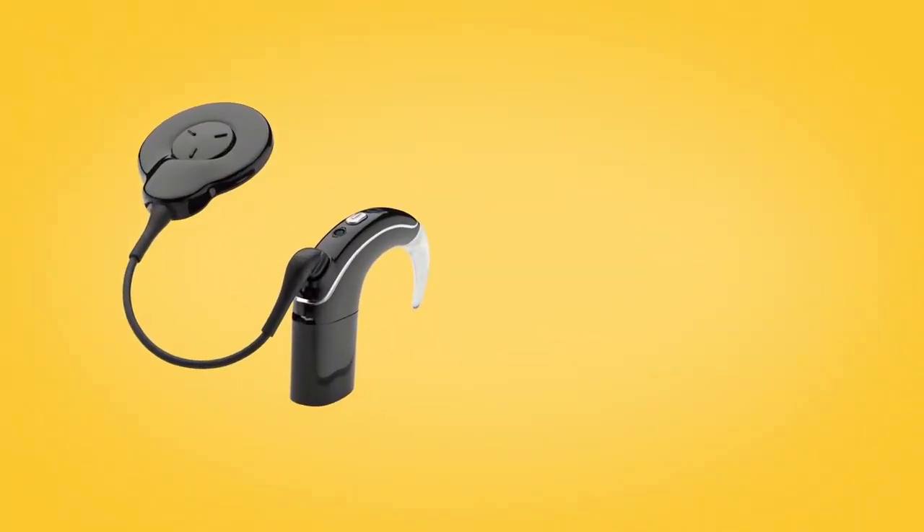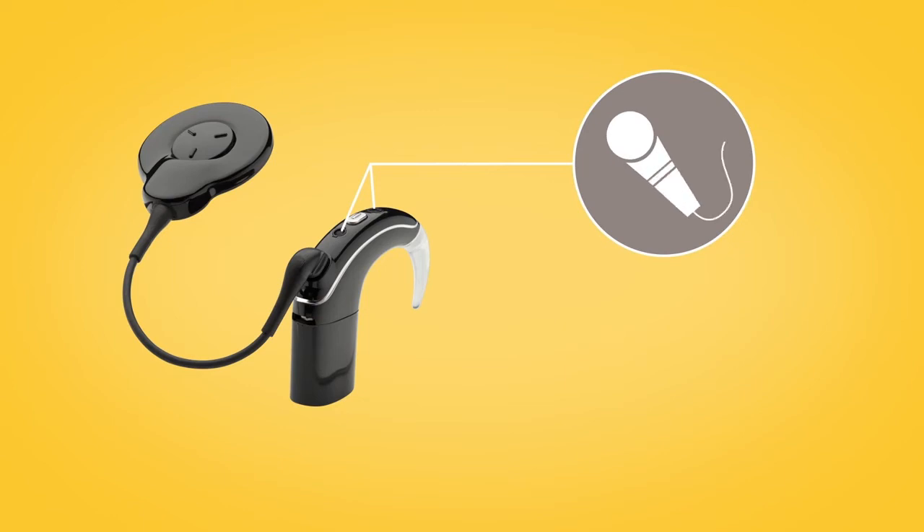It is important that you keep your microphone protectors in place at all times. Microphone protectors are built into the Nucleus 7 microphone cover, which is completely replaced.